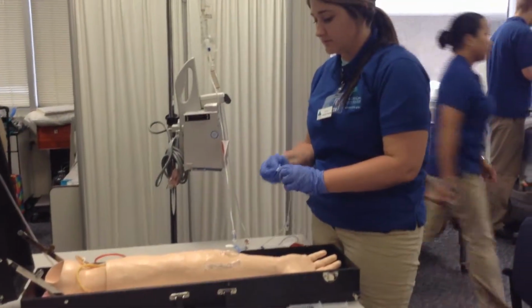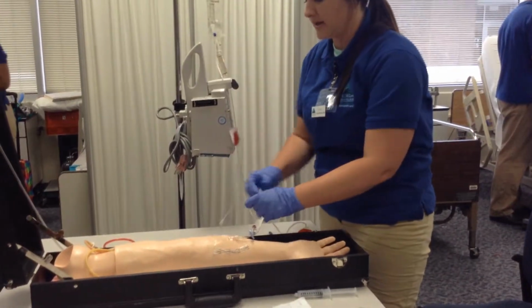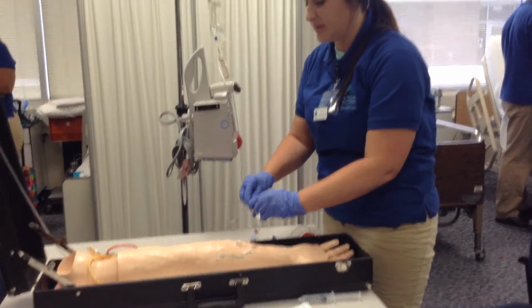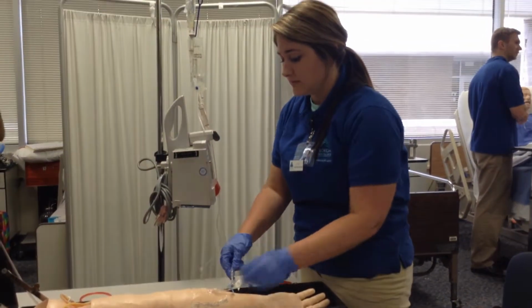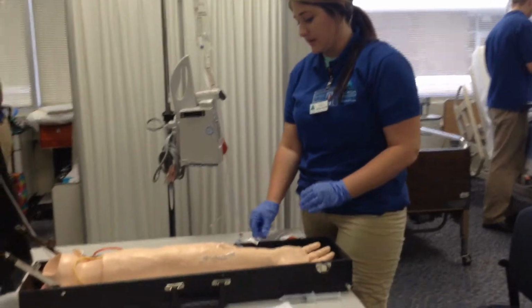And clean this port. With my mini bag clamped, I will then reattach the primary tubing. And I would unclamp my primary.